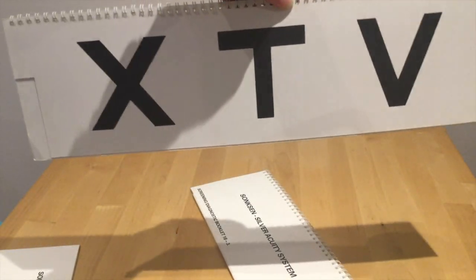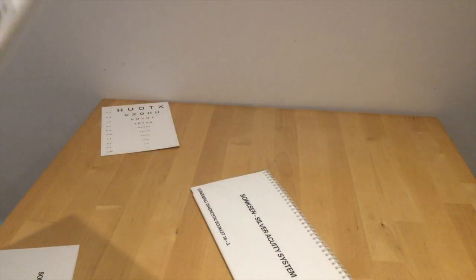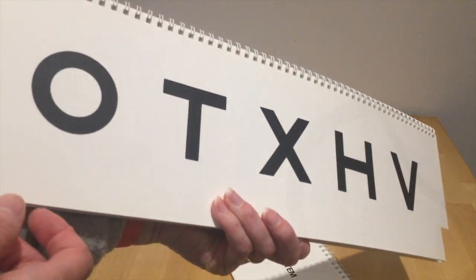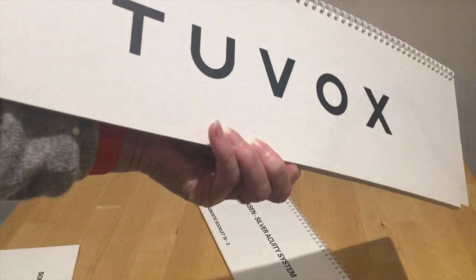And we've got our first, you can get that all in shot, 3 letters, XTV. And our next one, still same size, but another 3 letters. And then we go to the next size down, and we've got more letters on the 1 card. So it's really quite quick. 6/24 there actually. It's quite quick to do, and very simple.